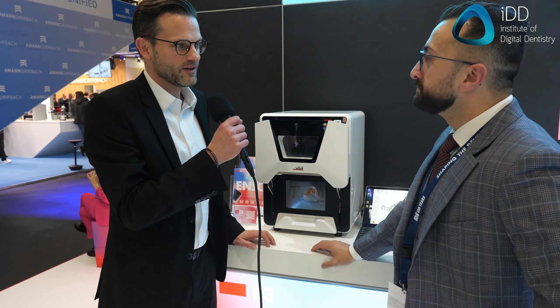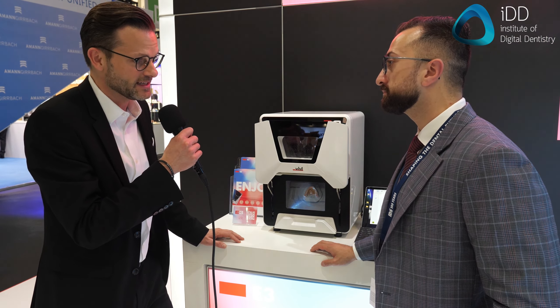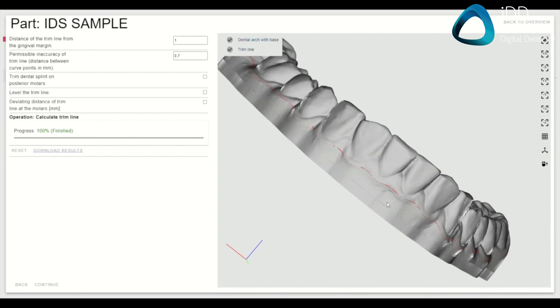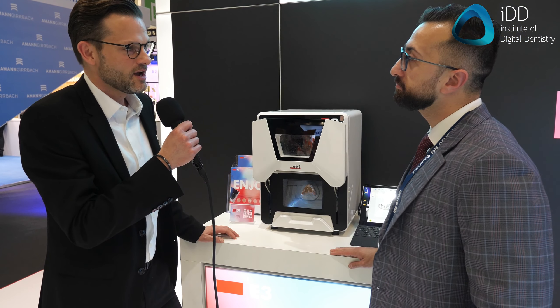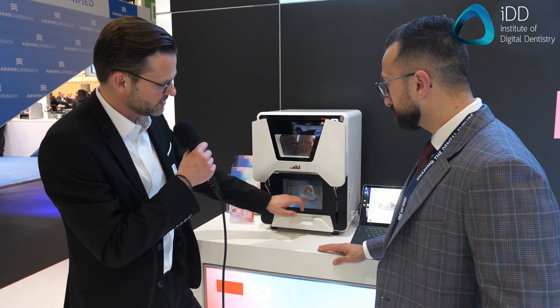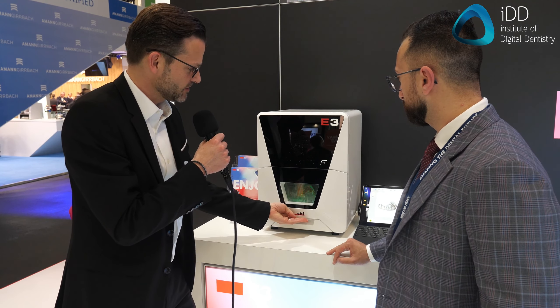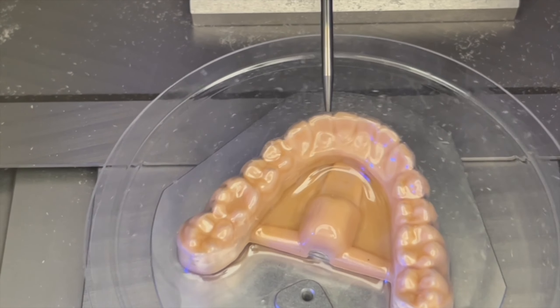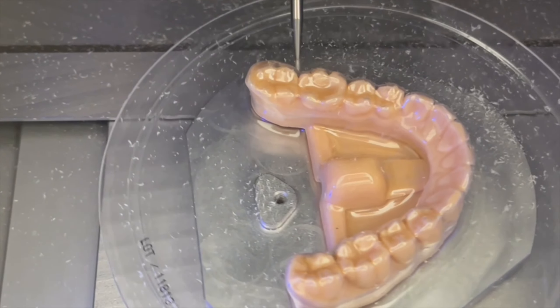These sorts of products are really bridging the gap of being able to do something like this in-house, even for the average dentist who may not do a huge volume of aligners. It's a very tedious and repetitive part of the workflow of that traditional aligner manufacturing, and this makes life a lot, lot easier. We have our own TrimCAM software developed for it that automatically detects the trim line of the aligner. It's a complete open system — you can use any intraoral scanner, any ortho planning software or service. You just import the STL to our software and we're going to see it in action now.